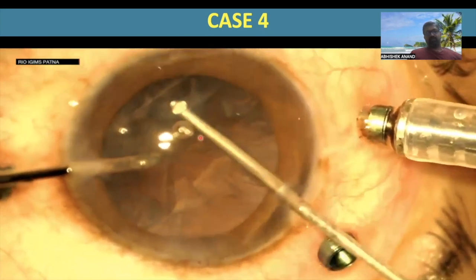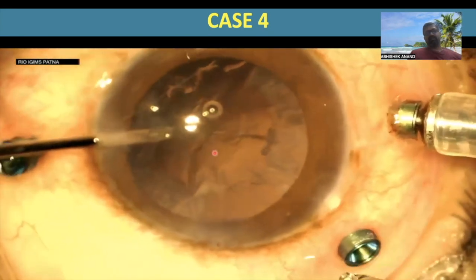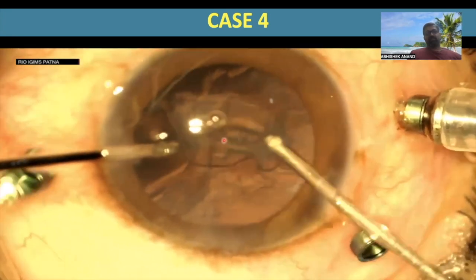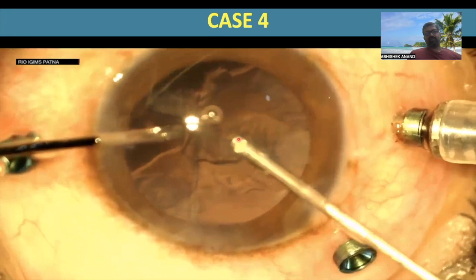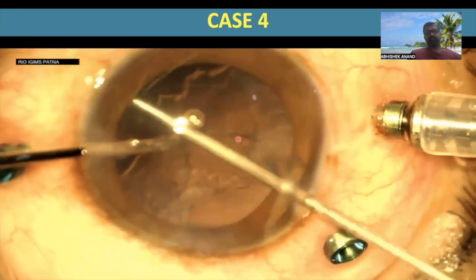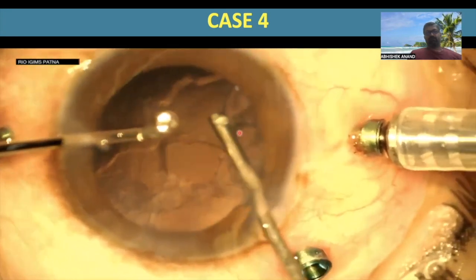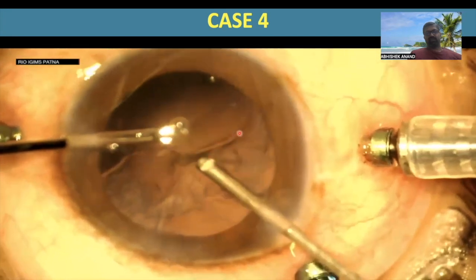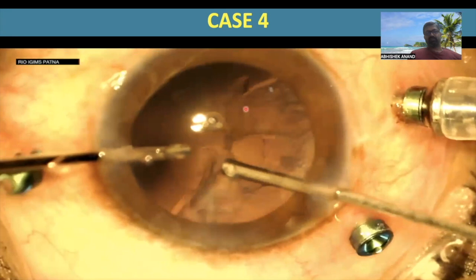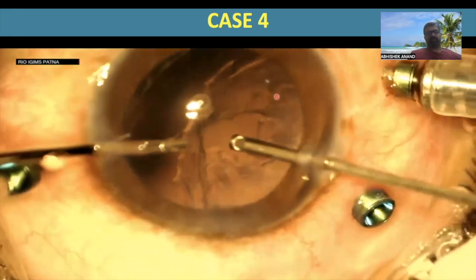Now, one of the advantages that the vitrectomy probe gives you is that you can use it alternately as a suction as well as a cutter. So we are aspirating as well as cutting the fibers, so undue traction to the peripheral cortical vitreous is not done. So what we see here is that the vitrectomy probe is effectively being used as a suction port and it ensures complete removal of the cortical vitreous.